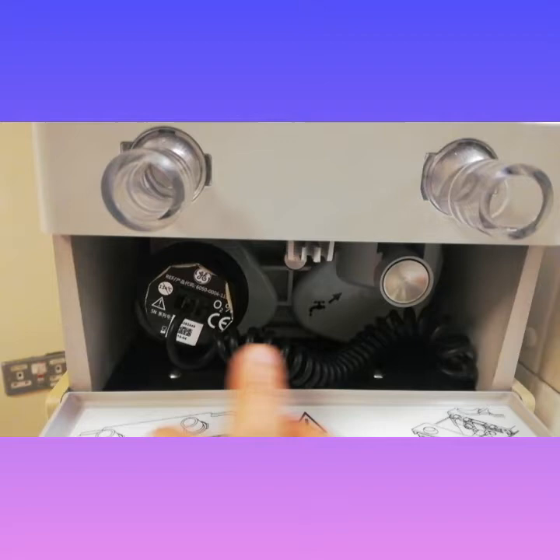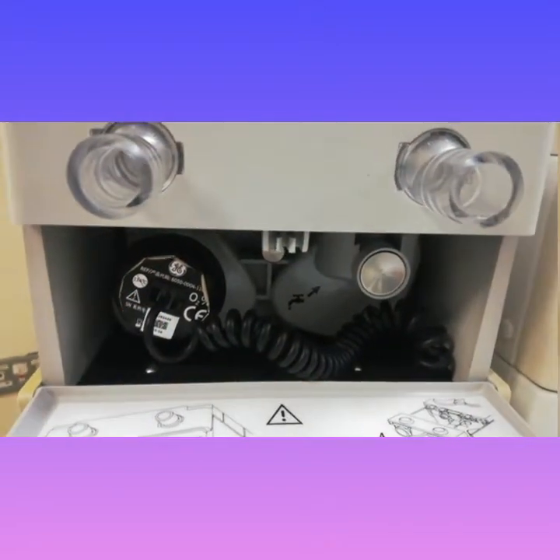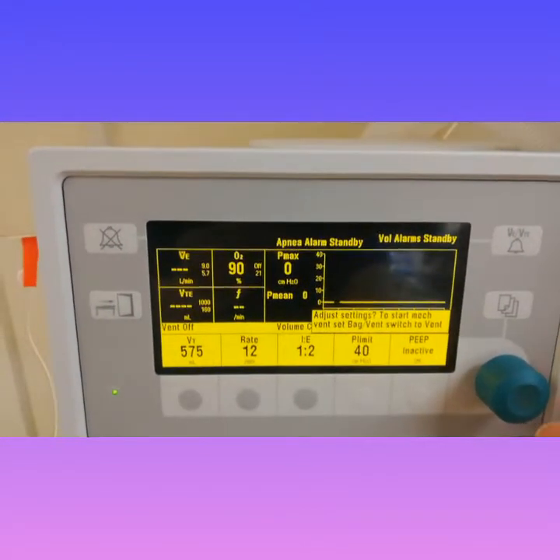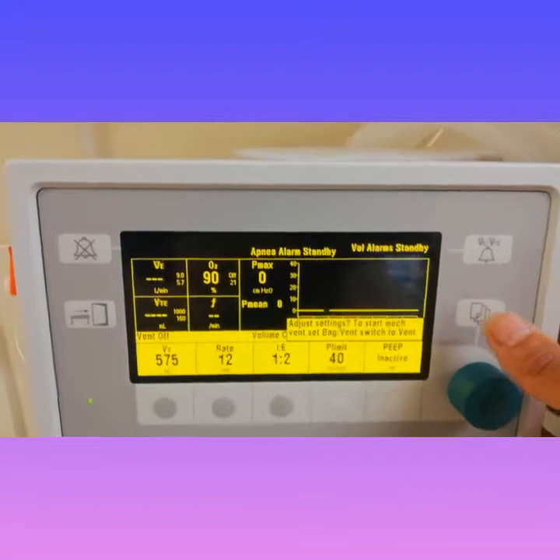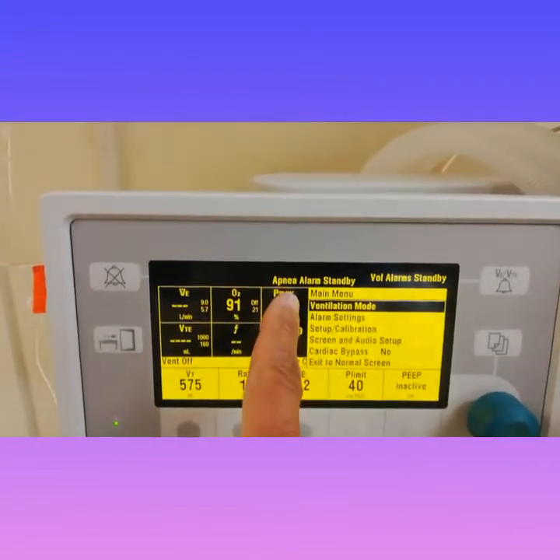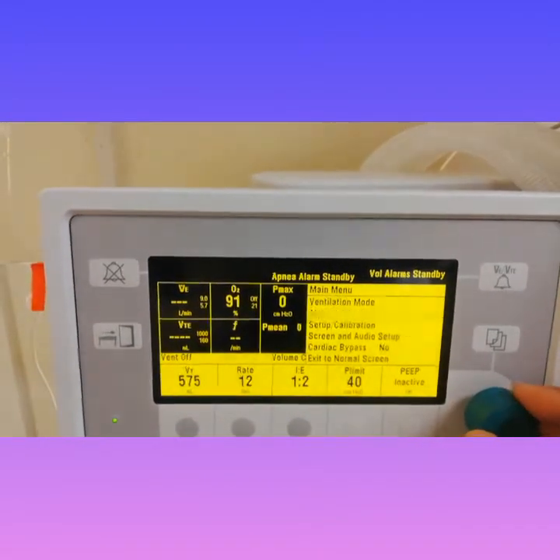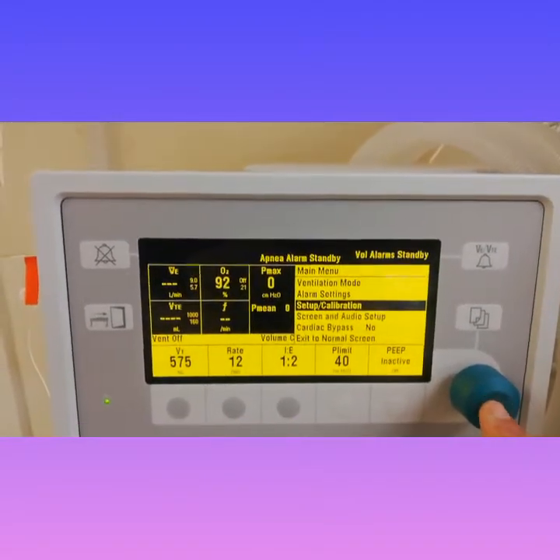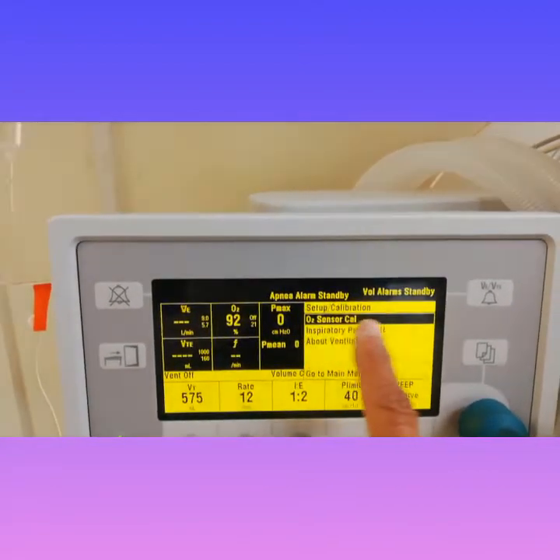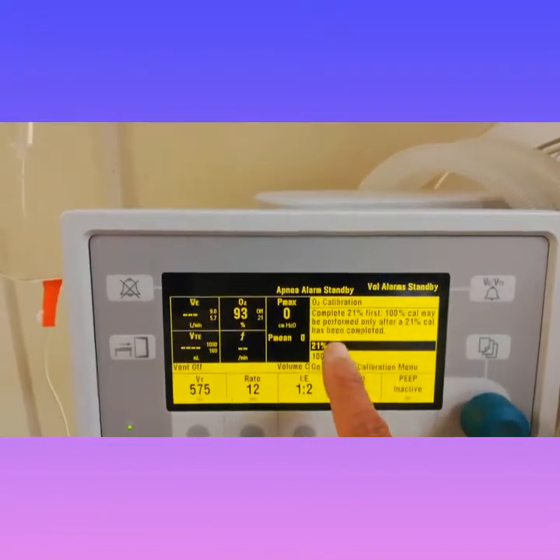The oxygen sensor performs the function of measuring inspiratory and expiratory oxygen concentration in anesthesia and respiratory devices. Here are the steps on how to calibrate the oxygen sensor. Firstly, on the monitor you're going to scroll down to setup calibration and press the green knob, then select the oxygen sensor cell.